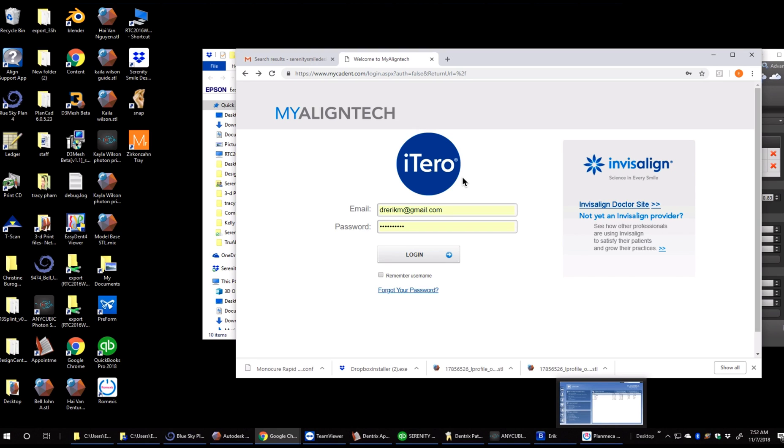I created this video to show how we export an iTero model through the MyAlignTech website. First step, we're going to log in.